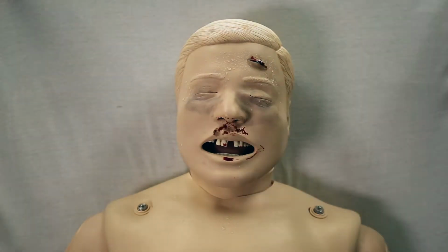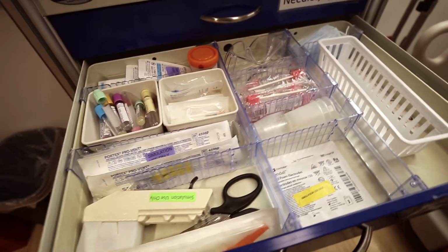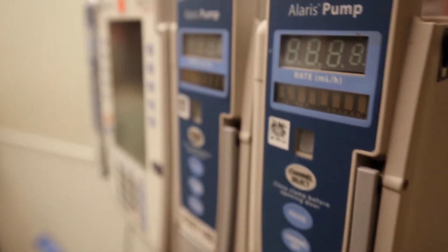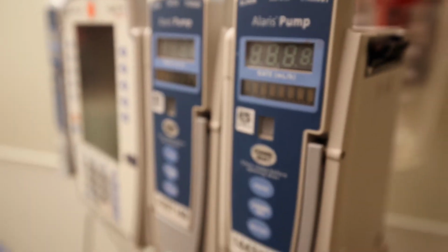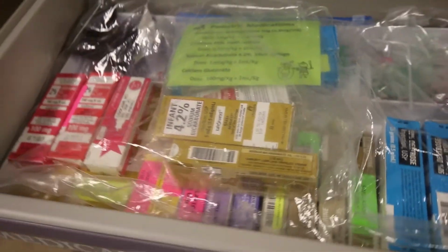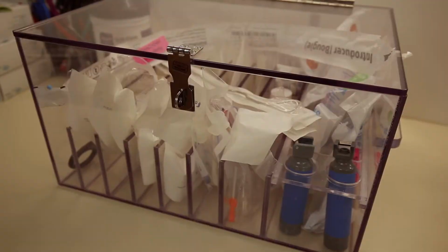When your scenario is complete, we want to make sure that none of the supplies used in the simulation leave the room. Many of these supplies can be collected and reused for future simulations. We also want to ensure that no simulation supplies are ever taken to an area where they may be used on an actual patient, causing them harm. Please check your pockets to make sure you're not taking any simulation supplies with you.